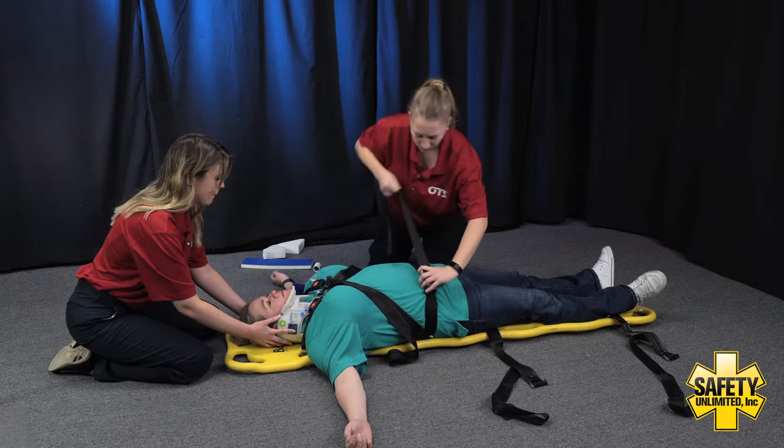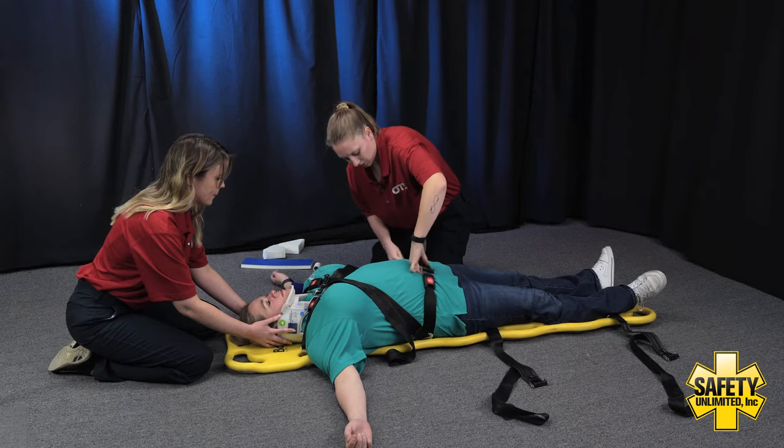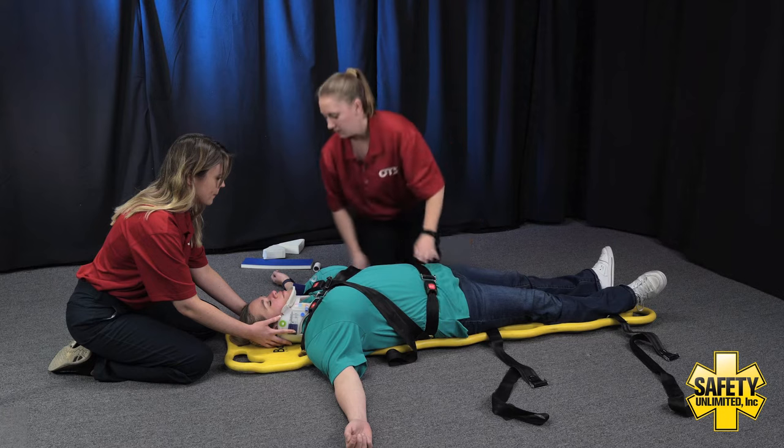We're going to go ahead and move to that waist strap. Go ahead and take a deep breath in for me. Go ahead and breathe out normally. Doing okay with those straps?